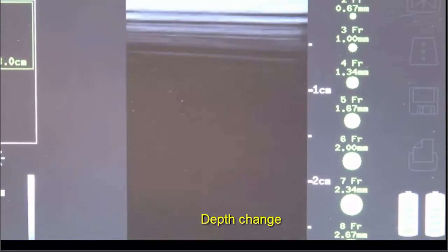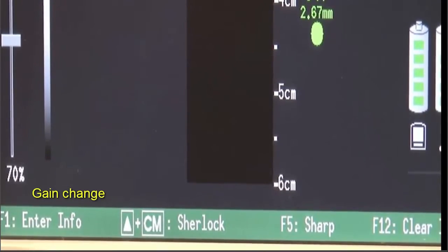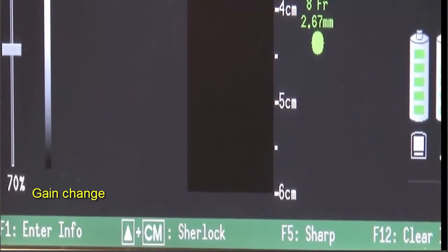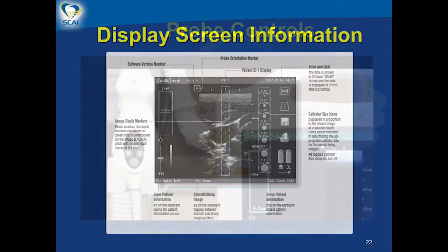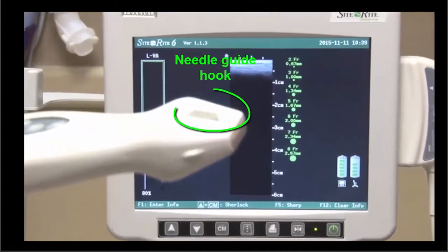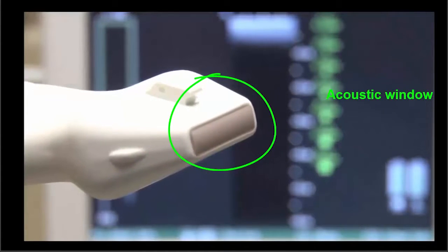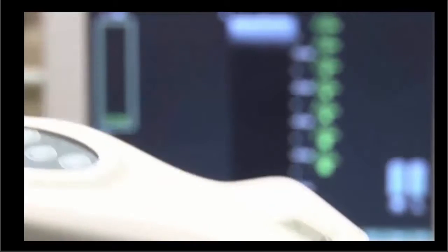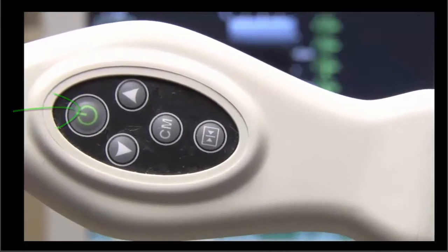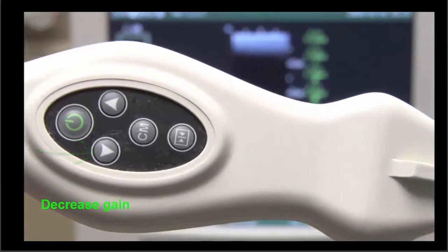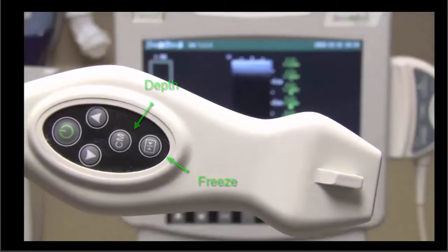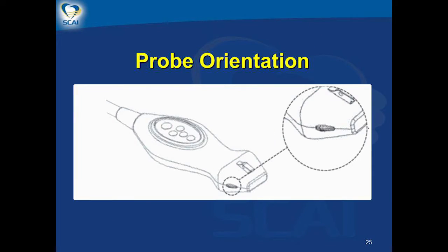Depth can be changed to image structures at different depths to adjust the focus and improve the ultrasound image. Image gain can be adjusted to amplify the signal; adjusting the gain affects the entire image, both target and non-target. The probe controls include the needle guide hook, probe orientation marker, and acoustic window, as well as on/off reset, decrease/increase gain, freeze image to print or save, and depth markers to adjust the focus.